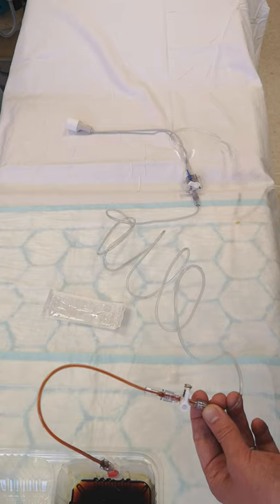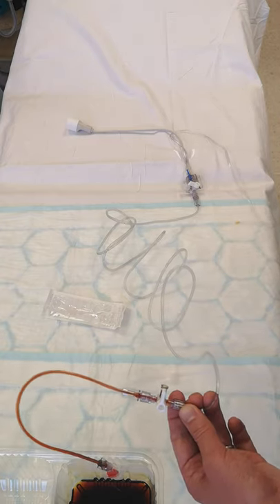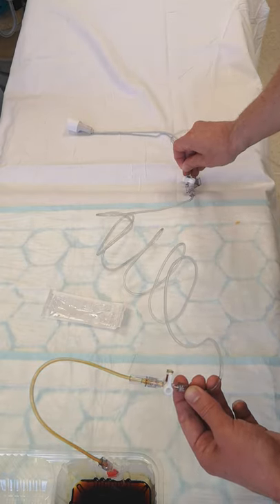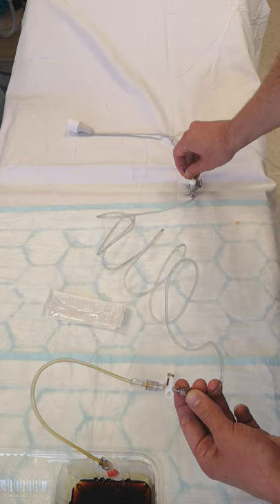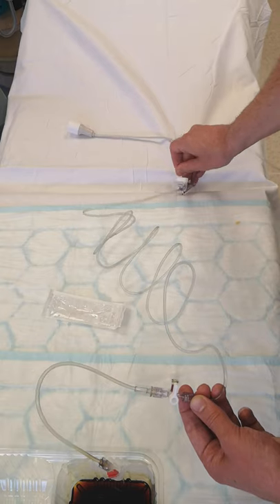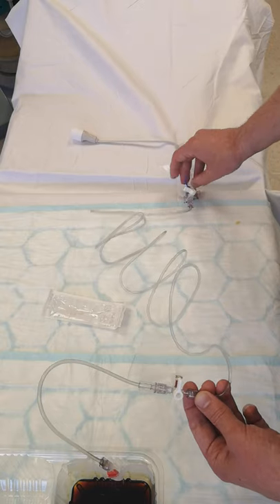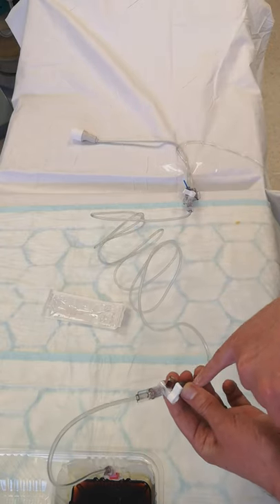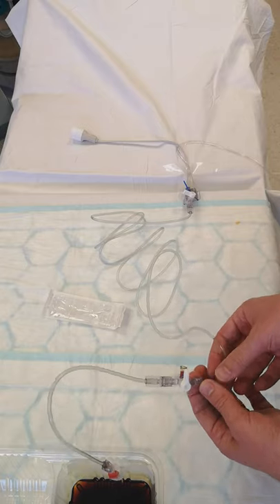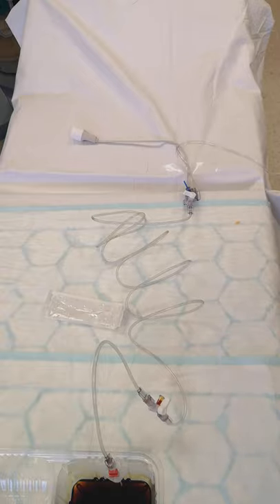What I hadn't done was open the rollerball on the pressure bag — that's why it wasn't flushing. Open that and it will flush through. You'll often have a slight residue of blood at the end, but as long as the majority is gone that's okay. Pulsing the flush slightly can sometimes help clear it.